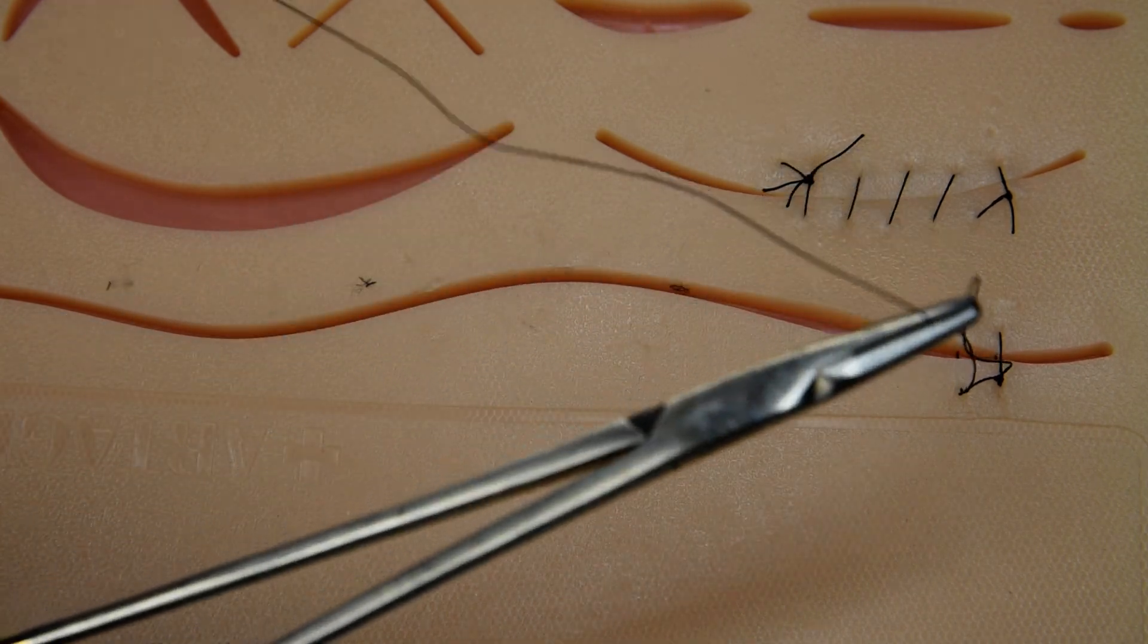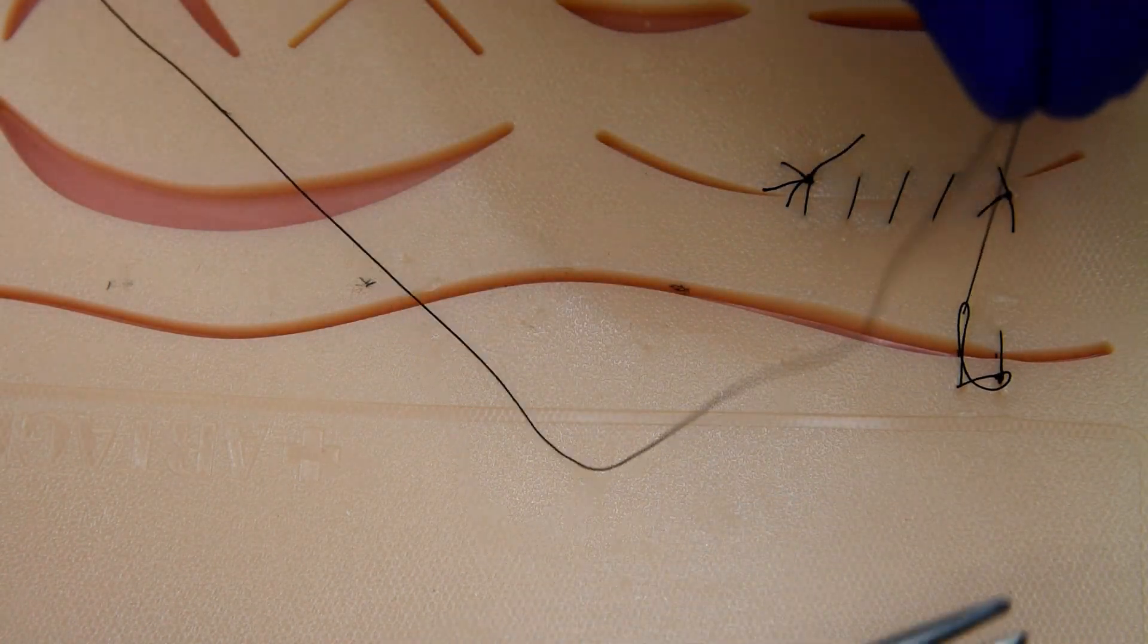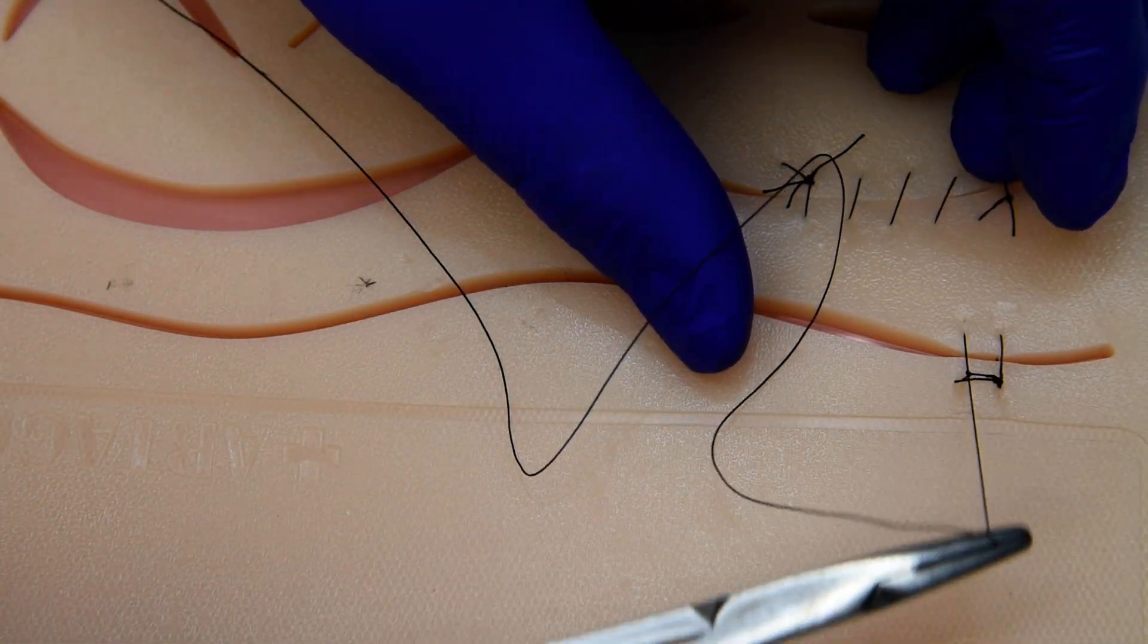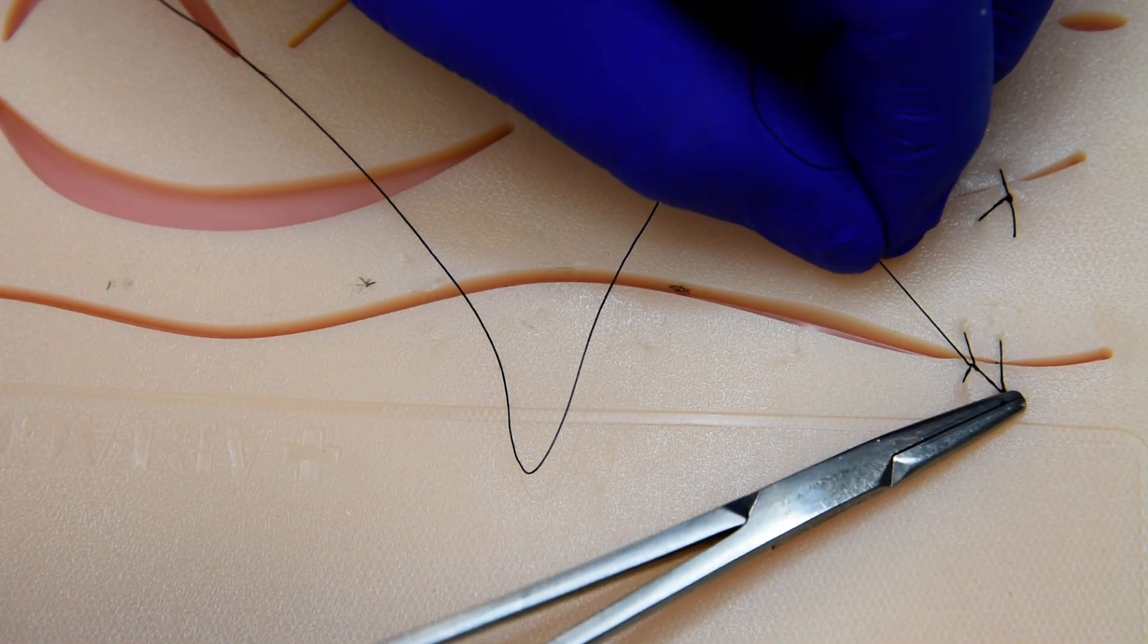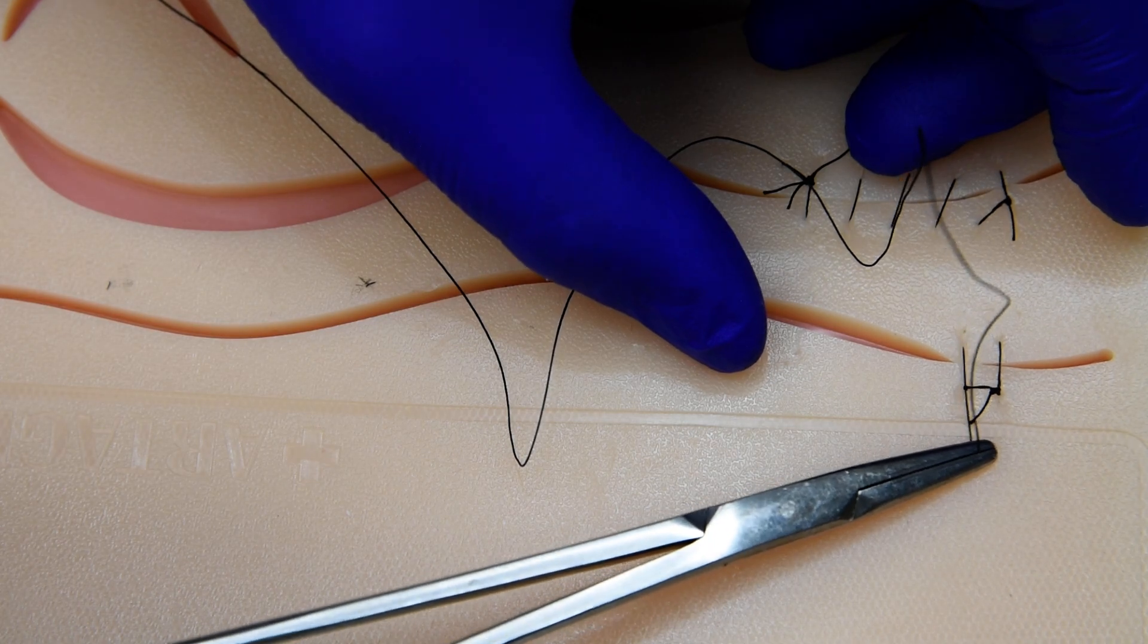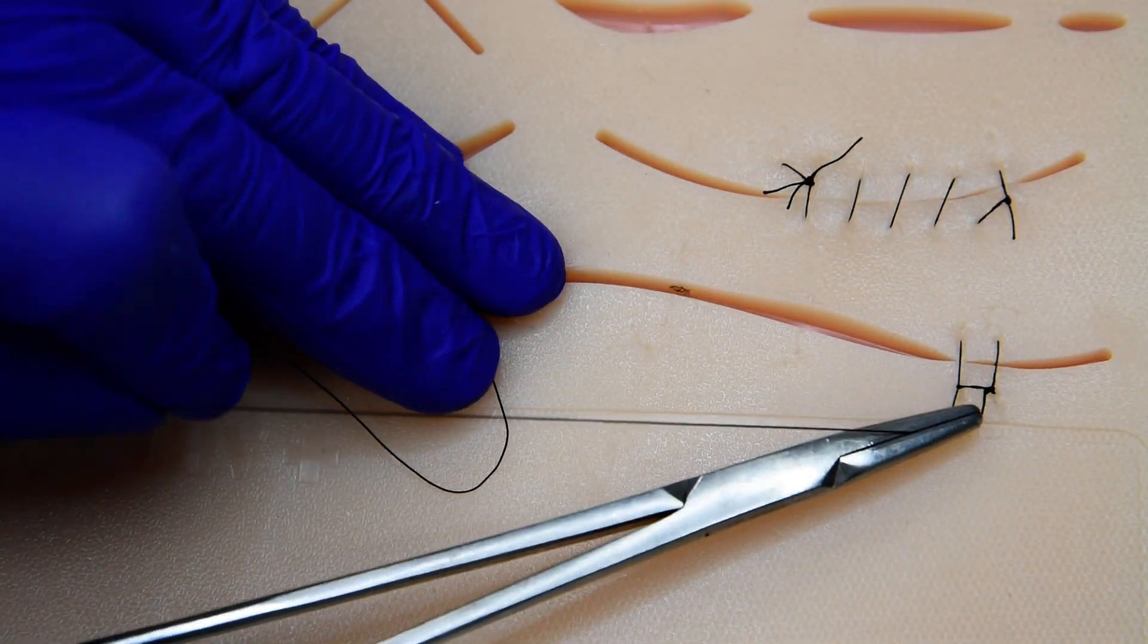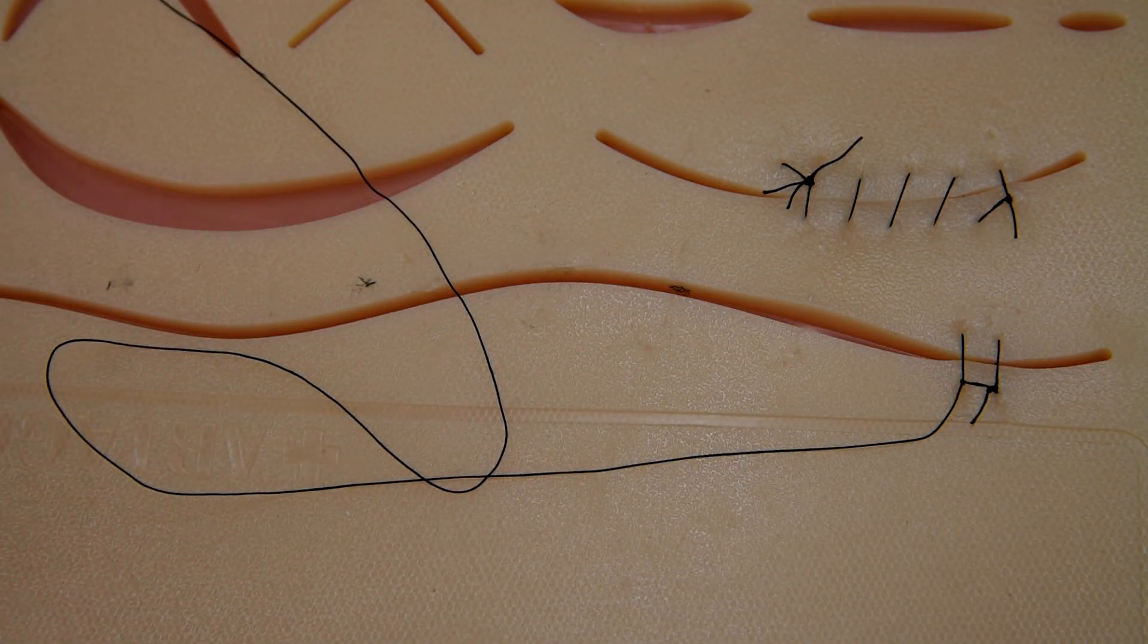Now as we cinch and tighten, careful not to lock ourselves out, especially with silk. When we get close to the knot being down, we're going to grab it and give it a little rock across the incision and then a lock to the side you're putting your knot on. Now you have tension going perpendicular to your incision line.